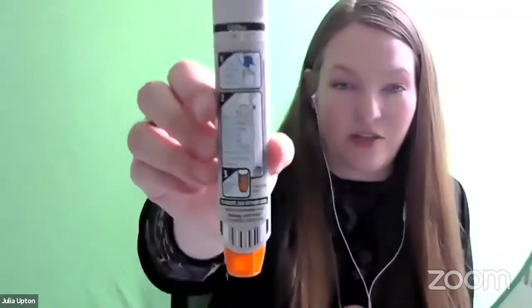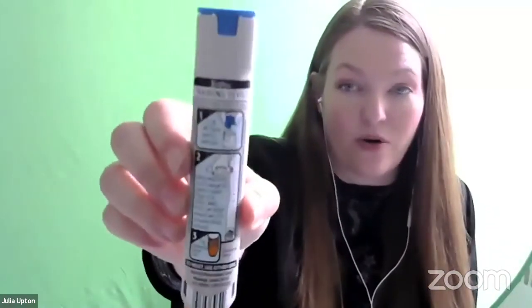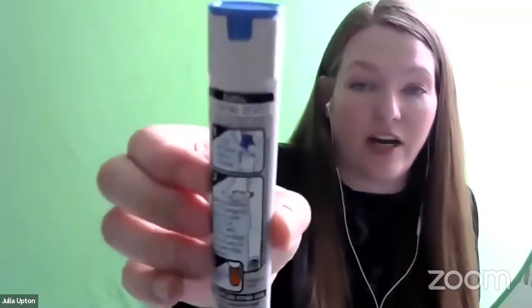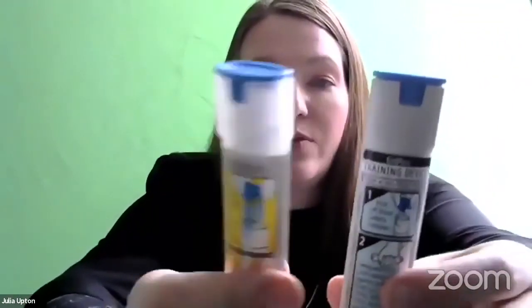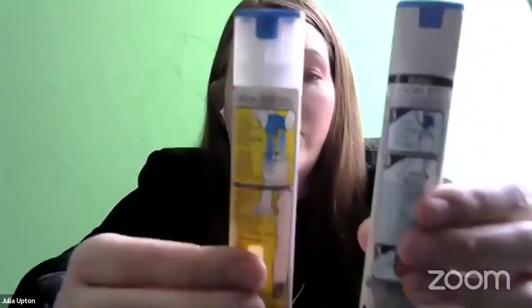Great, thank you so much. So this is the demo, or the trainer. They call it the training device of EpiPen. I also have the real one here, or what we call the live one, just to show you the difference, because many people have the trainer as well as the real one. So it is nice to make sure you know the difference.